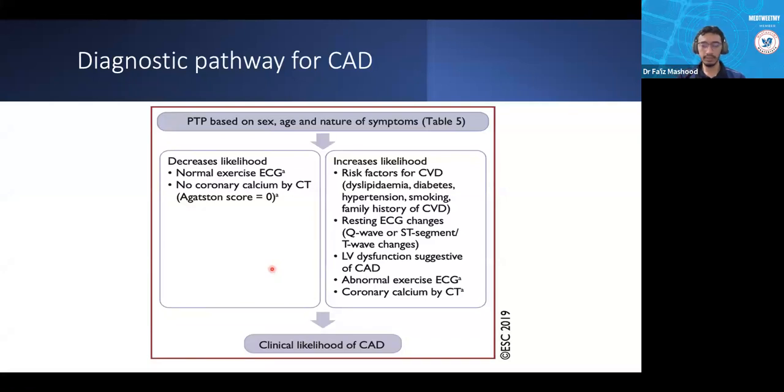For example, we have a patient in the intermediate risk group, but our patient has a normal EST, or a normal coronary CT and normal CT coronary calcium. From the intermediate risk group, we can consider our patient as falling under the low risk group instead, because they have one of these modifiers.